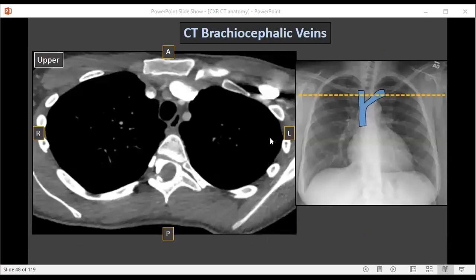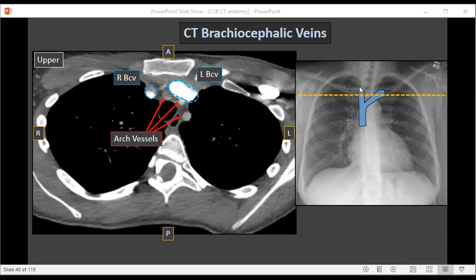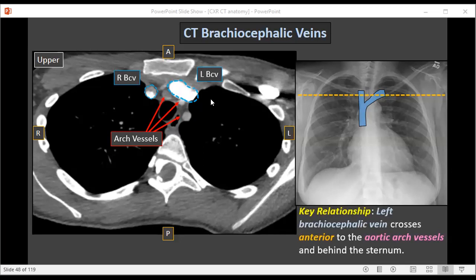On CT, looking at the same four axial levels starting again in the upper chest: we can identify that we're in the upper chest because we see three circles anterior to the left of the trachea — these are the arch vessels. Just in front of the arch vessels, we expect to see the brachiocephalic veins. We can see the left brachiocephalic vein crossing from left to right to eventually meet up with the right brachiocephalic vein. Notice the left brachiocephalic vein appears somewhat tubular because it's running across the chest, whereas the right brachiocephalic vein is more circular due to its vertical orientation. The key relationship: the left brachiocephalic vein runs just behind the sternum and in front of the three aortic arch vessels.